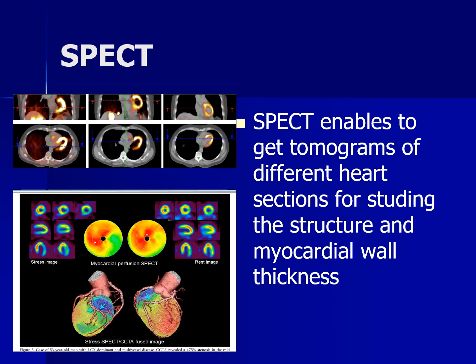SPECT is a combination of anatomical and functional information. It enables us to get tomograms of different heart sections for studying the structure and myocardial wall thickness.